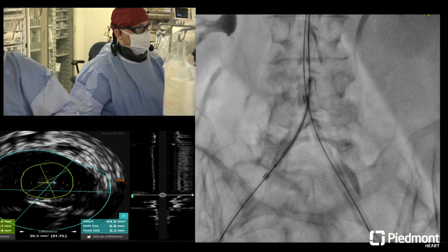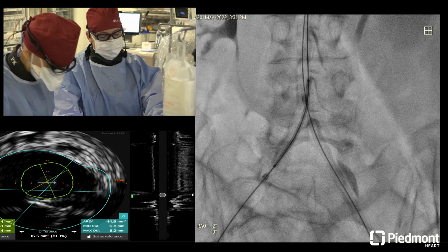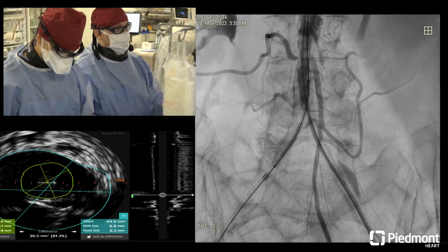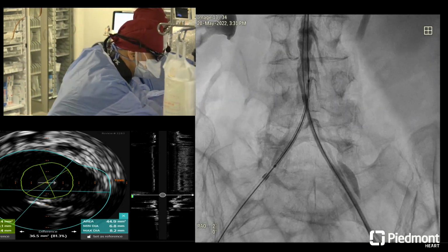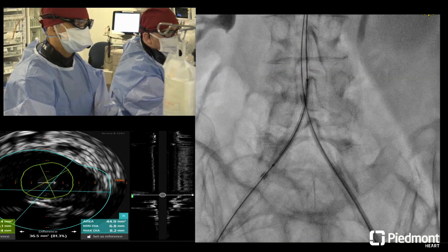So I kind of moved my strategy away. Extend the bite. I think where we're at right now, that seems to make the most sense. Extending the bite to me seems easier. So, what are you saying? I was going to say extending the bite up, just dropping 2 covered stents up higher. What do you guys think about that? Yeah, as opposed to an isolated aortic stent. I think that's what the slight debate was here. Good. Yeah, I kind of like right where that is.